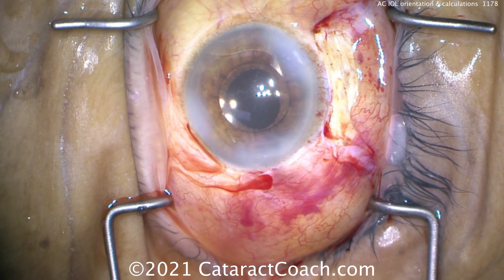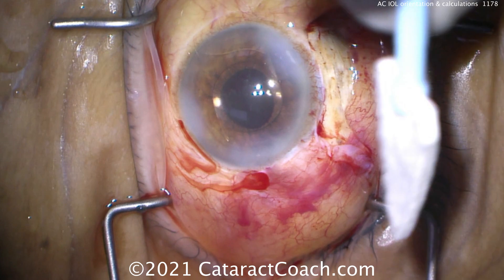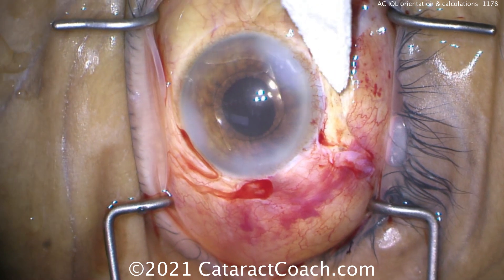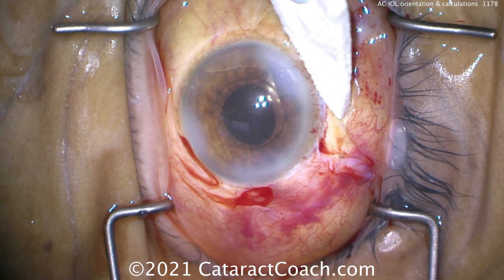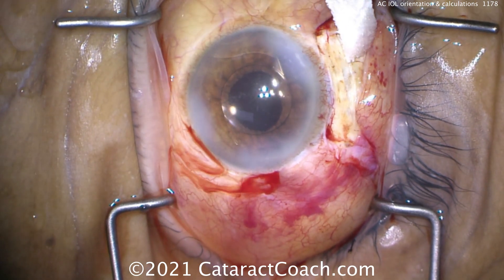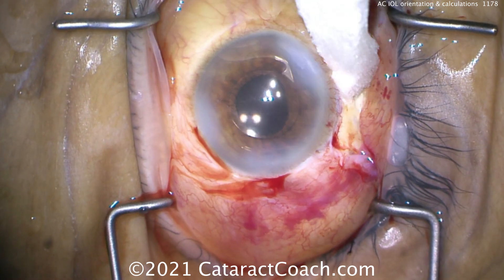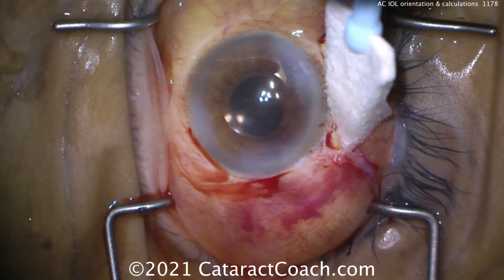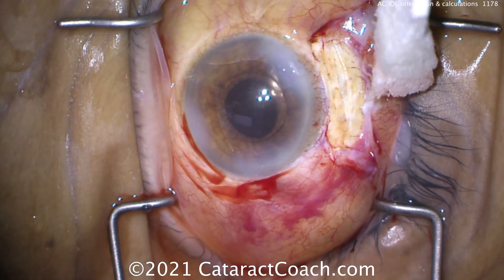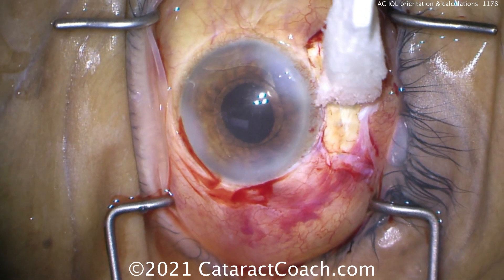You want to orient these haptics — these footplates — in the angle. I like them in the horizontal plane, so the patient's 3 o'clock to 9 o'clock position. That's going to give the best support with gravity, as opposed to putting it at 12 and 6. Keep it horizontal, with the haptics parallel to the floor of the room — 3 o'clock, 9 o'clock, the patient's horizontal meridian. Also, if the pupil looks very peaked, that means you've trapped iris under one of those angle-supported footplates, and you need to readjust. Here the eye looks great.